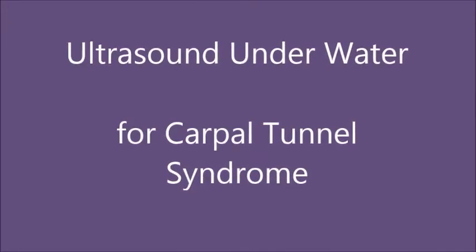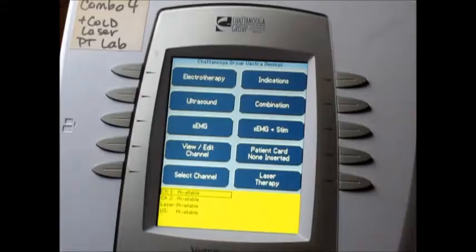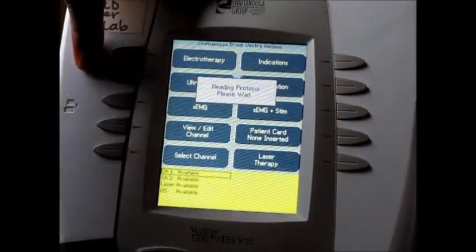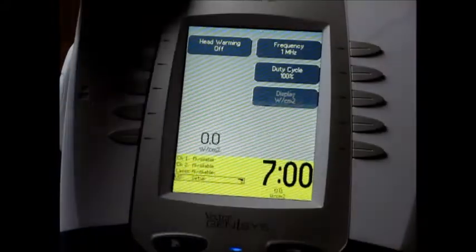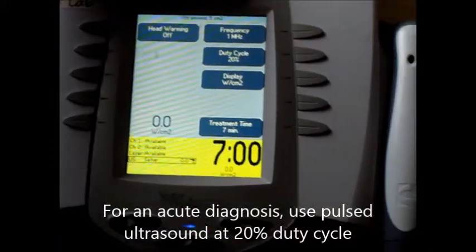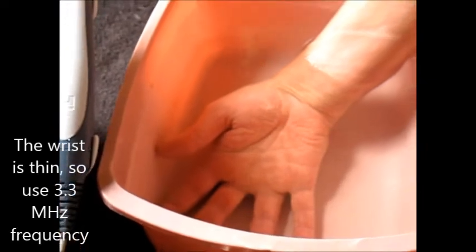Using ultrasound underwater to treat carpal tunnel syndrome. Next we're going to be doing some ultrasound. I'm using a Chattanooga, and this patient has an acute carpal tunnel situation, so we're going to use the 20% duty cycle. This is a pretty shallow area, so we're going to do 3.3 MHz.